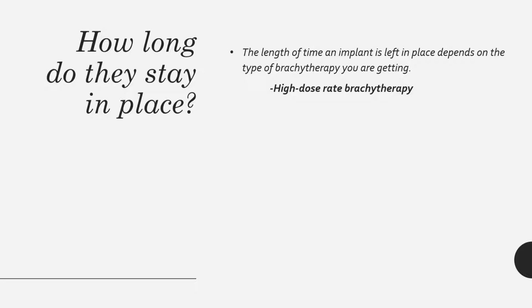High dose rate brachytherapy, if you're receiving this, allows a person to be treated for only a few minutes at a time with a powerful radioactive source that's put in the applicator. The source is removed after several minutes. This may be repeated over the course of a few days to weeks, and the radioactive material is not left in your body. The applicator might be left in place between treatments, or it might be put in before each treatment.